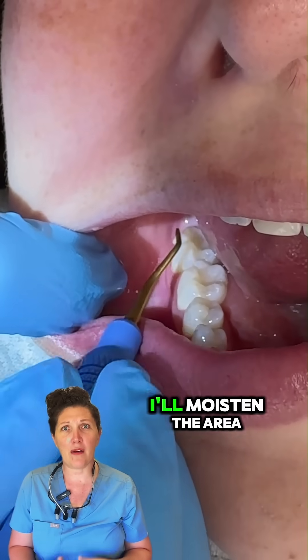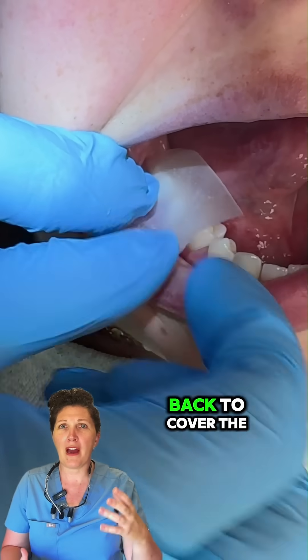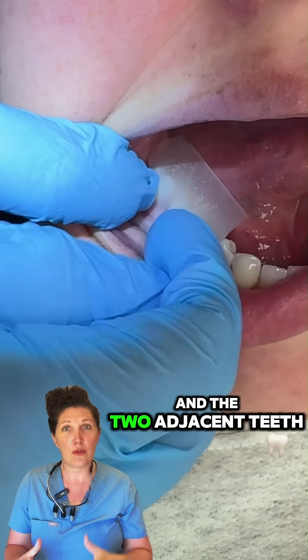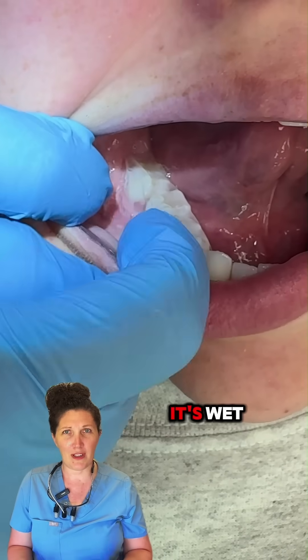After performing dental caries care, I'll moisten the area and place the strip against the sensitive tooth, pulling it over the back to cover the affected tooth and the two adjacent teeth. The strip will stick best moist to the teeth and begins to dissolve when it's wet.